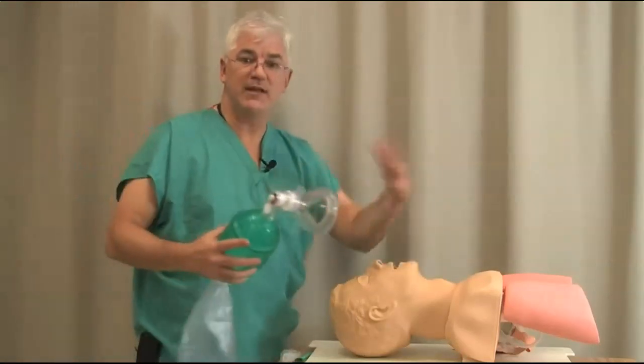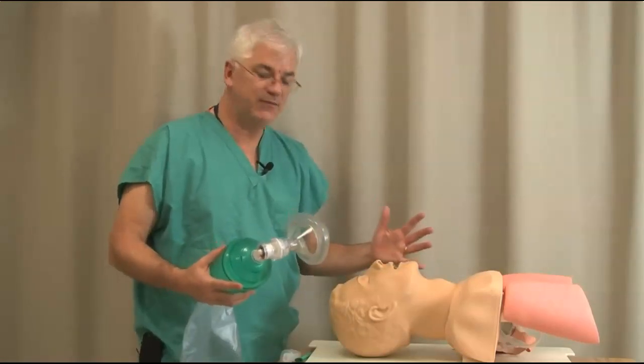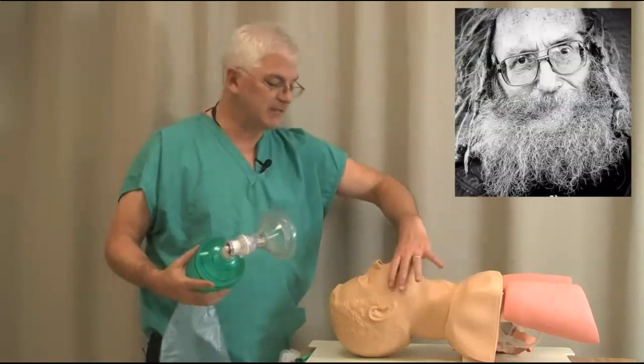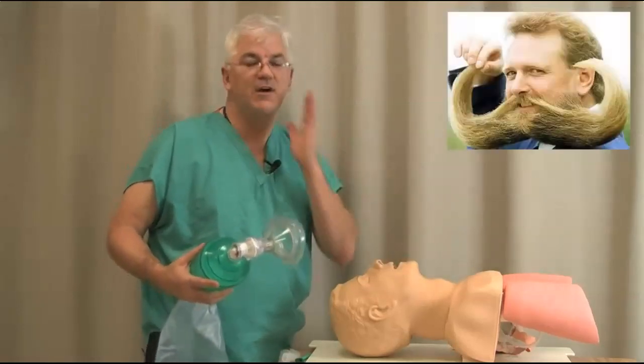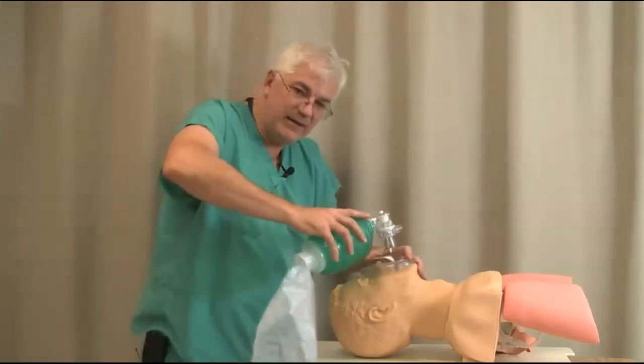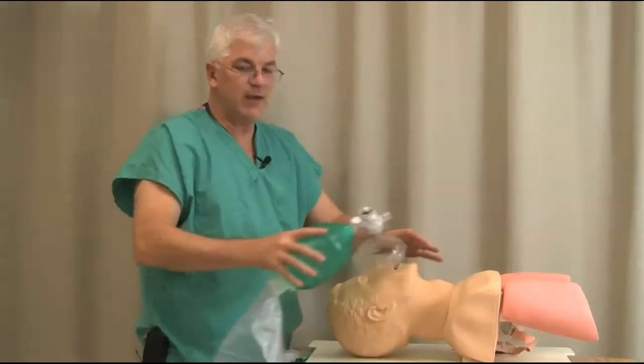Now, a couple of things about mask ventilation. First, like everything else, you want to do a history and physical on the patient to see if there's anything that's going to make mask ventilation difficult. Beards in particular are a real problem. If someone has a big beard or a big mustache, or even stubble, I have a little stubble here myself, it can make it really hard to get a seal. So you want to check for that.